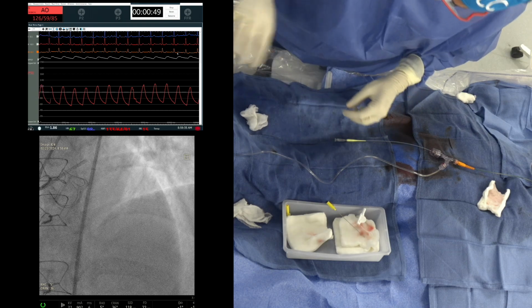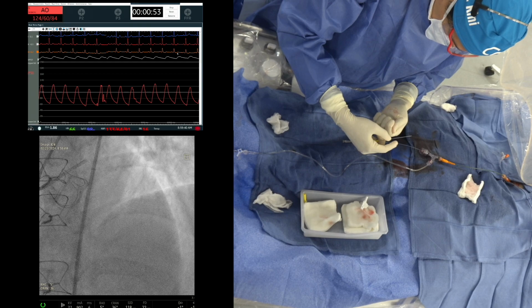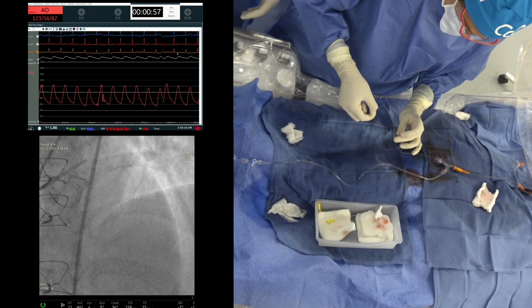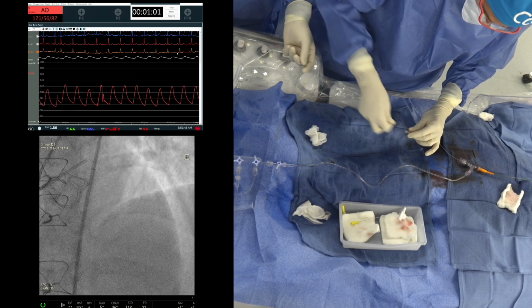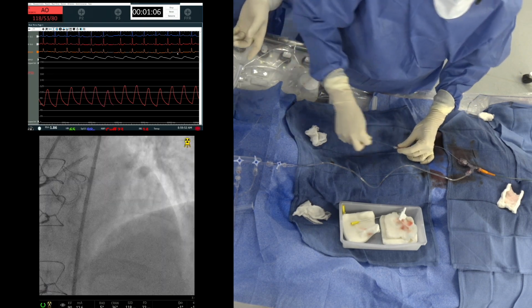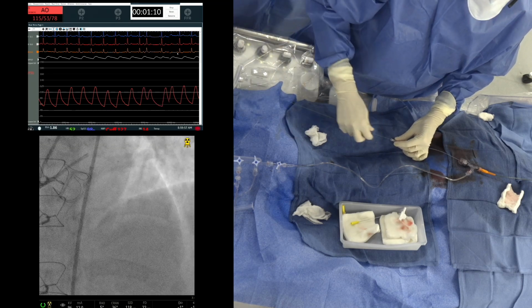Yes, go to the Fielder, any wire. That's what we are doing. That's what we always teach, and that's what we are going to do. Anytime you try to cut short, it's not good. We always try with the rota wire first. If it happens quickly, we are good. But somehow the tip has not been destroyed, yet it's still not making the turn into the LAD.